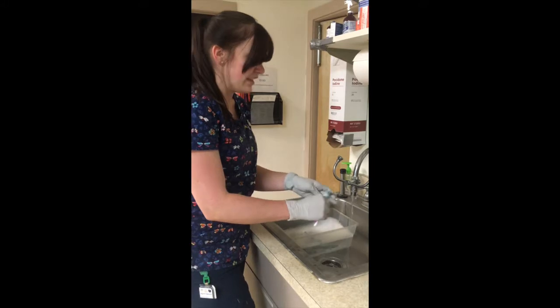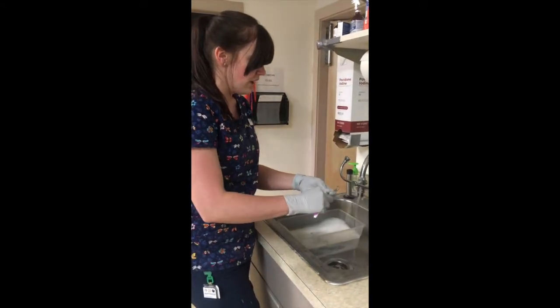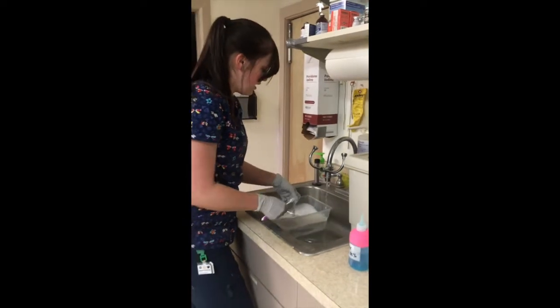If your instrument has hinges on it, you want to make sure that you scrub them with open and closed, down all sides, including the handles. Rinse it off, put it in the ultrasonic. So I'm going to go ahead and finish scrubbing these.